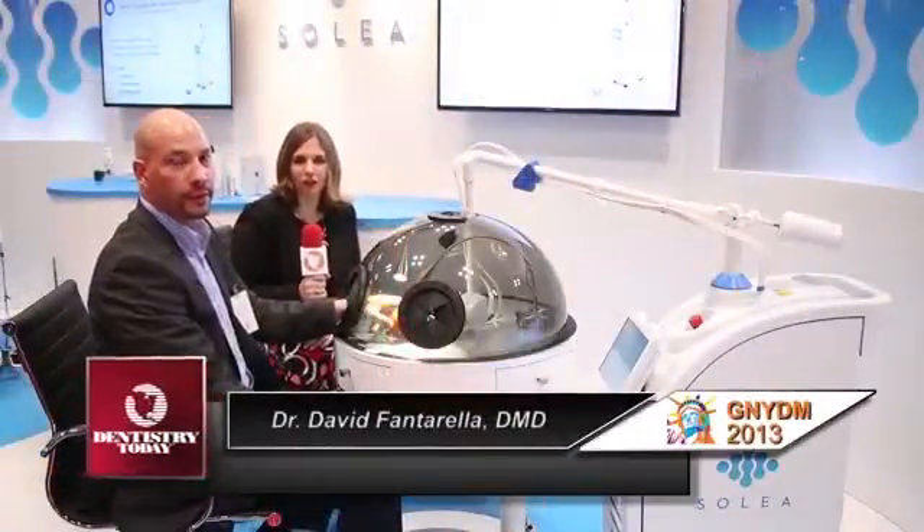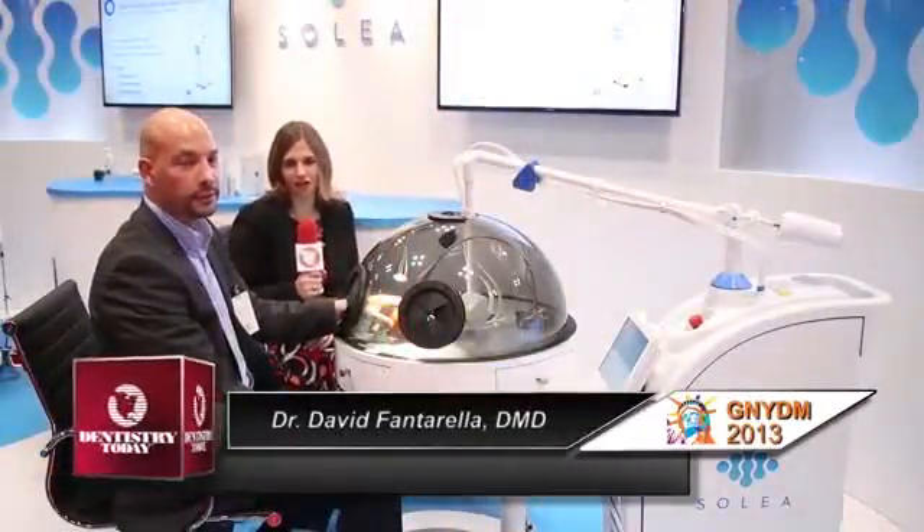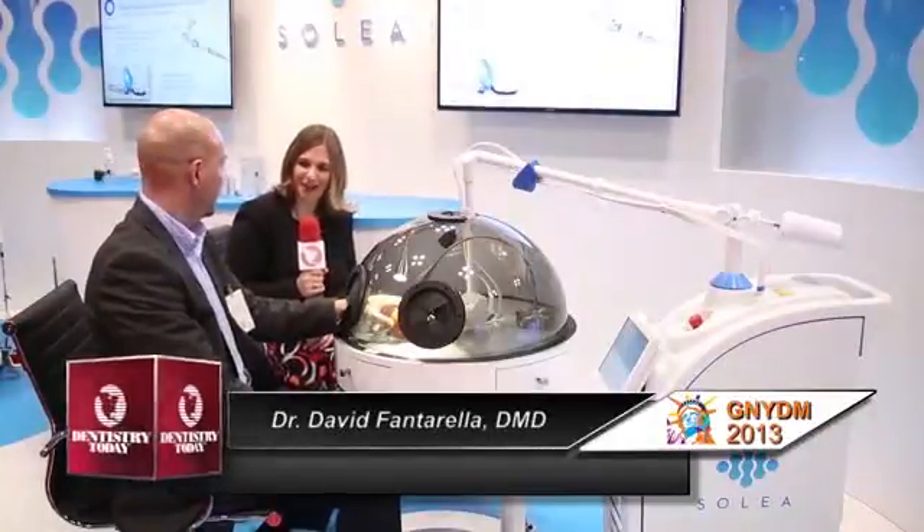I'm here now with Dr. David Fantarella, who is going to walk us through a demonstration of Solea. Dr. Fantarella, take it away.